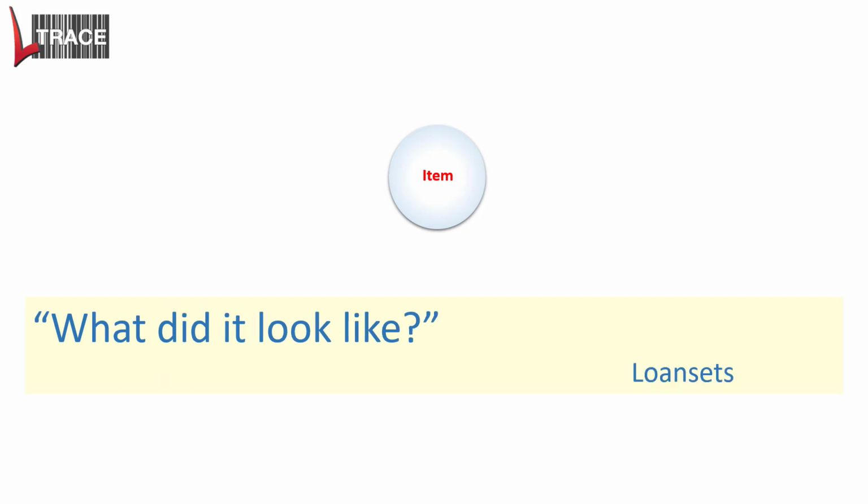What did it look like is a really useful question, especially when you start talking about loan sets. So what did it look like when we received it? So what is it meant to look like when we return it?